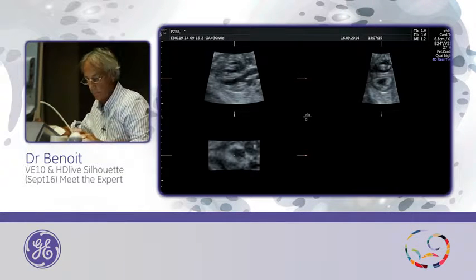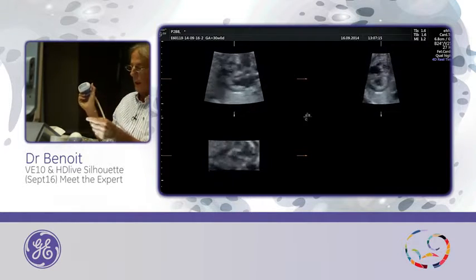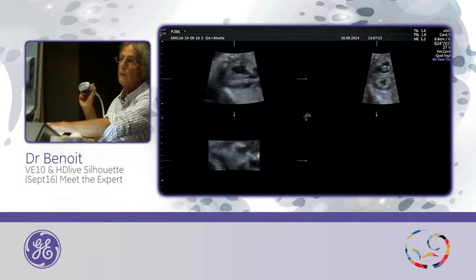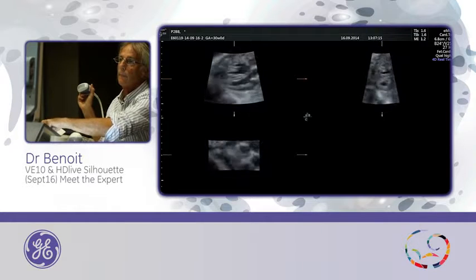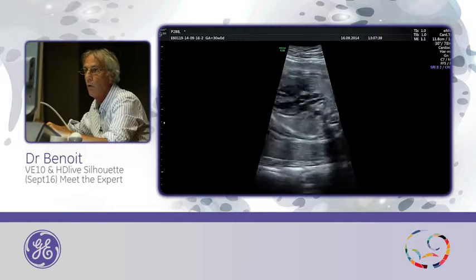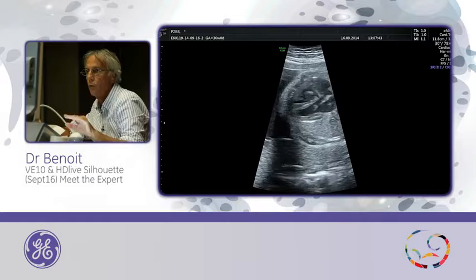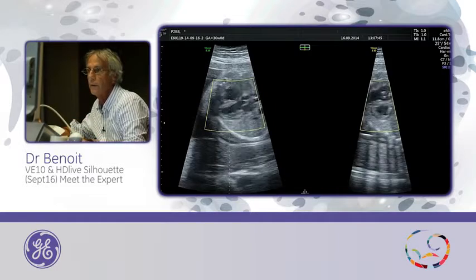This is 4D of the heart, and now you can move on it. So you can do a STIC, but also a 4D of the heart. I will do it again, here, without movement. Start.